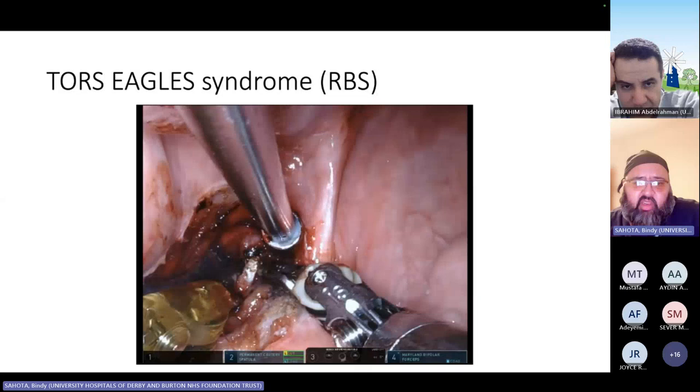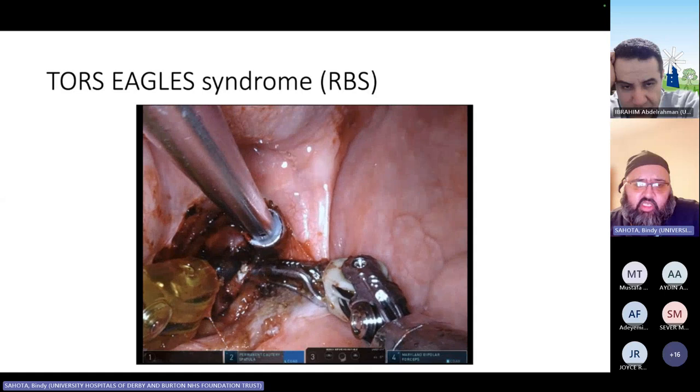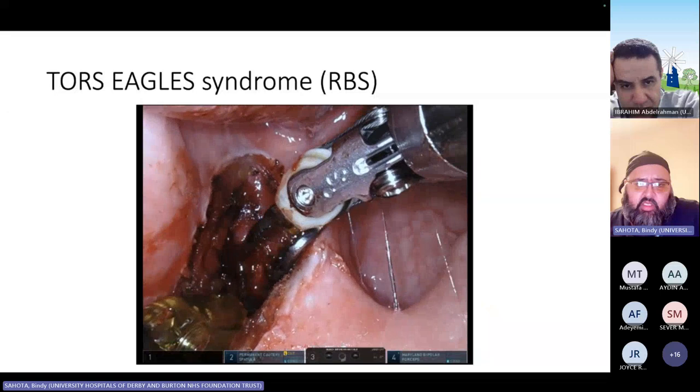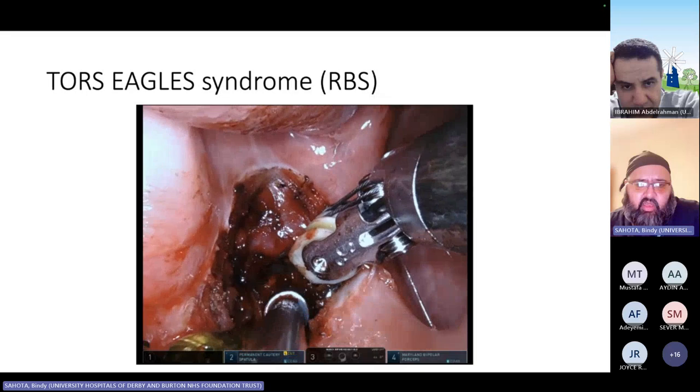And then what you do is you mobilize this and you chase it upwards, remembering that your carotid artery is only going to be 3 millimeters lateral to you there at that point in time. So it's just making sure you're in the right zone. And so what I'm going to do in a second is just get it a bit drier, because it always does bleed a little bit around here. You've just got to be a bit meticulous with it.